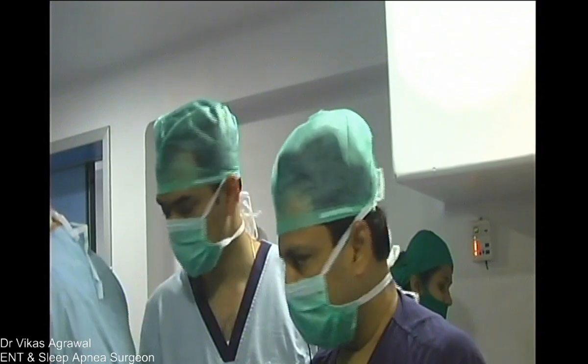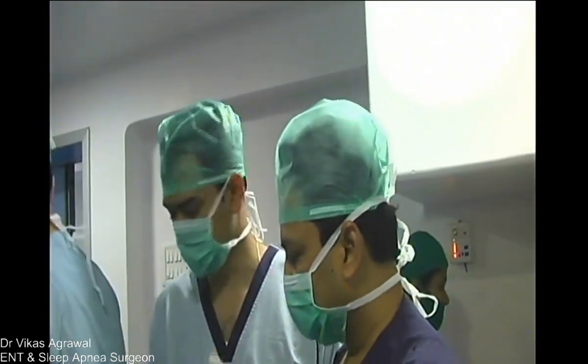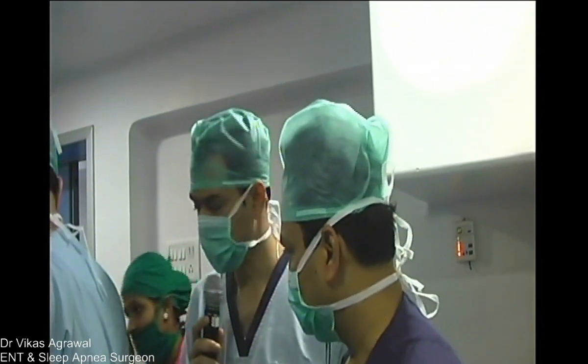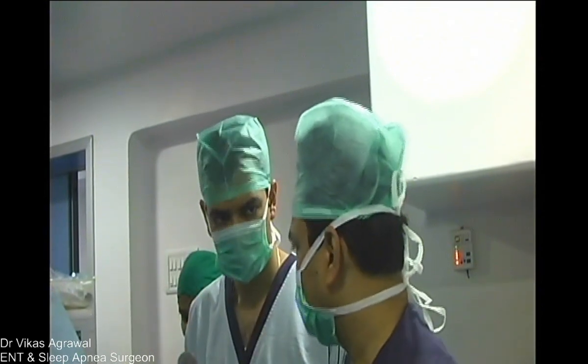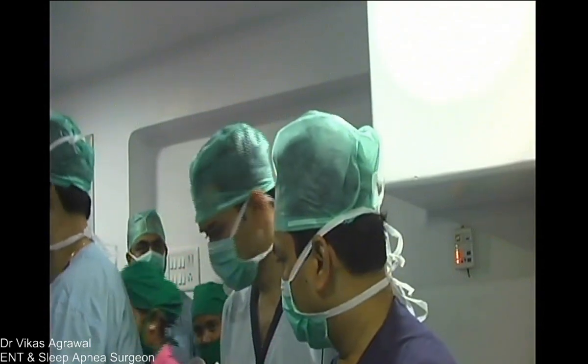The first case, as we are going to do, Rahul, we just finished the drug-induced sleep endoscopy of this case. He's got a palatal collapse as well as a nasal deviated septum, and turbinoplasty will be required. Septoplasty, turbinoplasty, and uvulopalatopharyngoplasty of my technique. That's what we are going to do.